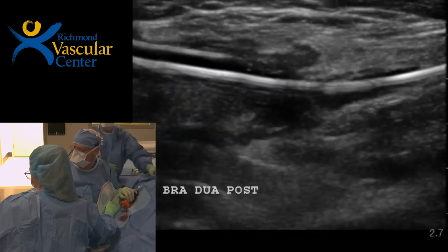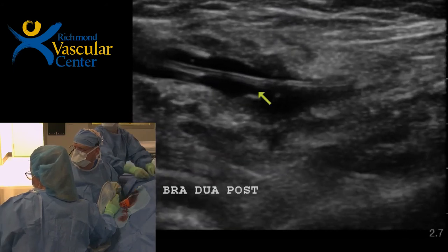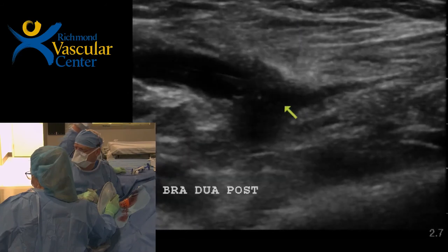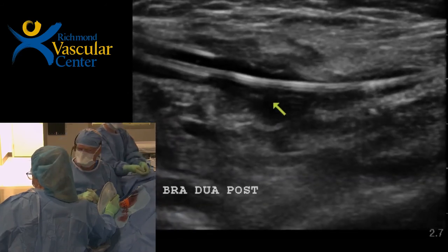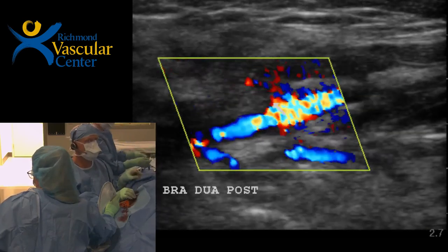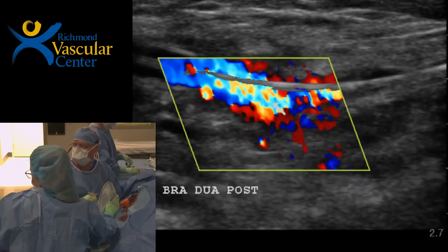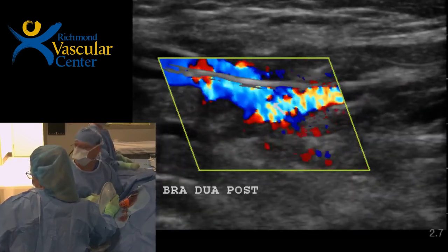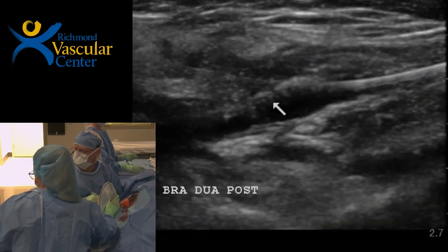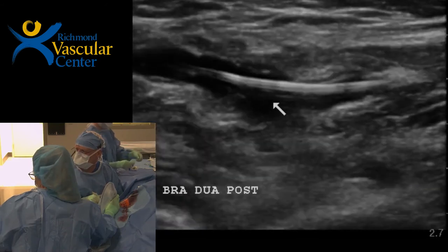Yeah, let me have a 4 millimeter balloon. Because it kept sliding out of the anastomosis, I'm not sure I got the anastomosis as open as I would like. All the way to the left. Well, it looks pretty open. So go slow on that. She has small arteries, small veins, so 480 may be all we'll get today. I was hoping to see a little improvement after ballooning.